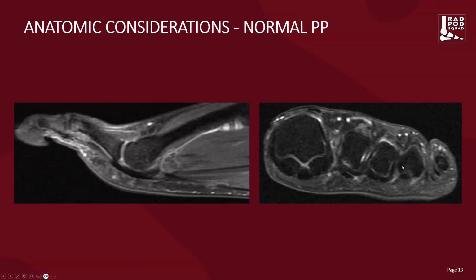And here we can even see some of the attachment of the phalanx, the plantar plate phalangeal ligament at its typical triangular shaped proximal phalangeal base. And of course, just to throw in for extra, there we can see our sesamoid complex, we can see the flexor tendon, and of course the collateral ligaments and the accessory collateral ligaments reinforced with the beginnings of our first plantar plate complex beginning at the metatarsal side.